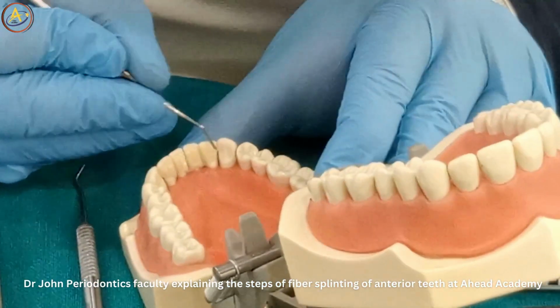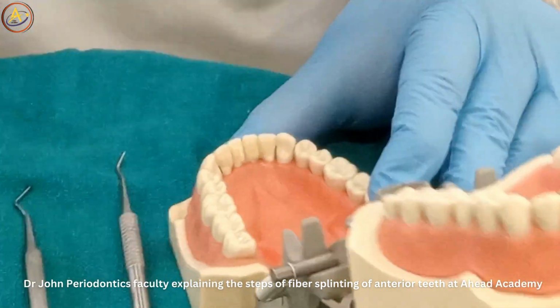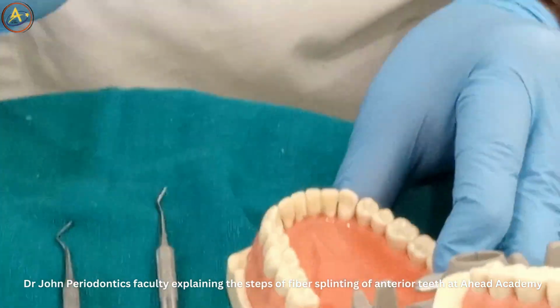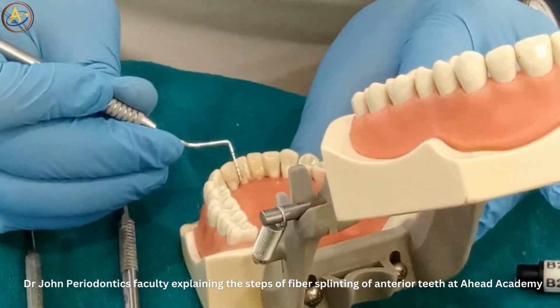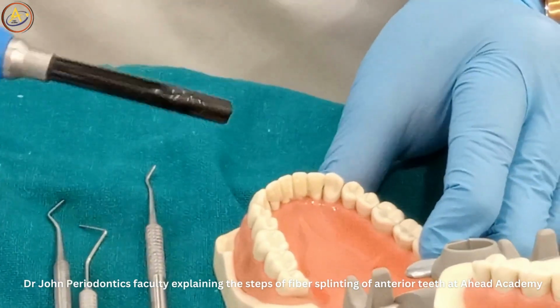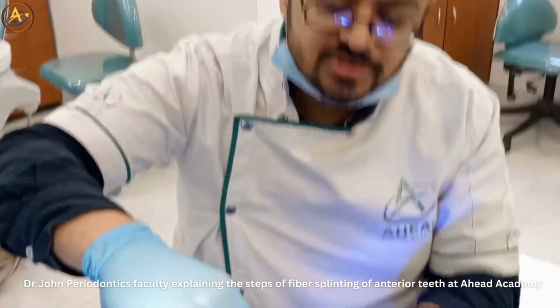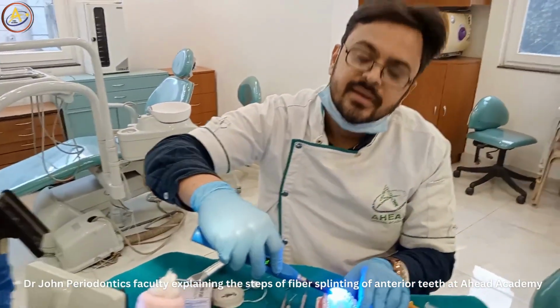When you are sure that my occlusion is fine, my cervical is perfectly fine, interdental, the composite has gone. This is the main thing, composite should go internally. When it goes internally, it will hold the composite. And when you are sure it is perfectly tight, internally locked, no contact internally, then what you do? You cure it again, 20 seconds per tooth. This is the most common splinting in the clinic, that is the plain composite splinting.